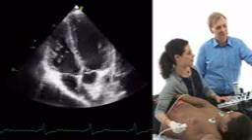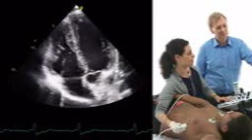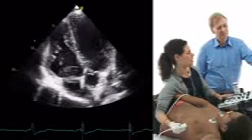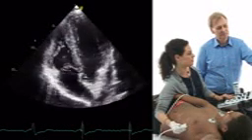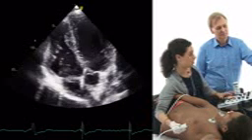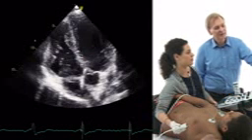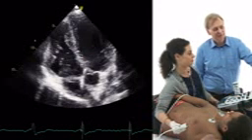We get a nice view where we see 2 leaflets of the tricuspid valve opening. We freeze it, and we simply measure the distance between the septum and the lateral wall. So pretty much at the same level that you would measure the left ventricle.